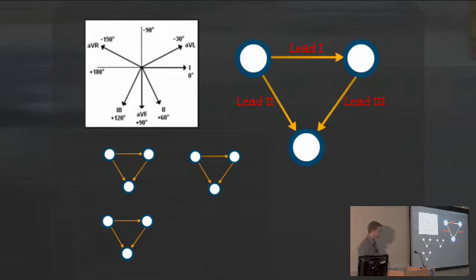For lead 3, now we're taking the negative electrode as the left shoulder, and we're looking at the electricity spreading towards the green, which is here. So that is going approximately at 120 degrees, in that direction. Dead simple. One negative electrode, one positive electrode all the time. So that's your leads 1, 2, and 3, the limb leads. They're called the bipolar leads.